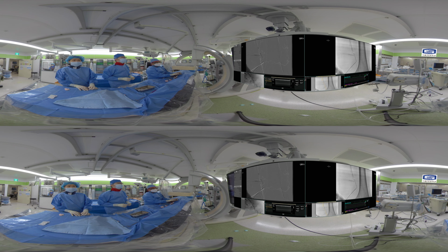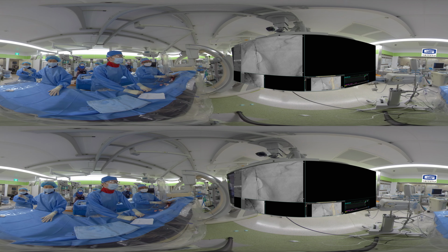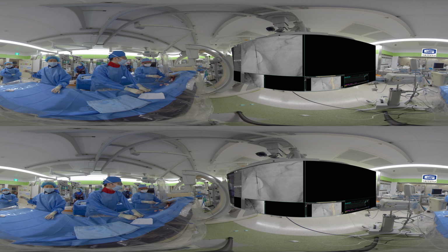After re-entry failure in the distal SFA, distal SFA puncture was done under ultrasound guide. A V18 wire was advanced proximally and captured by a 10 mm gooseneck snare in the left common femoral artery.